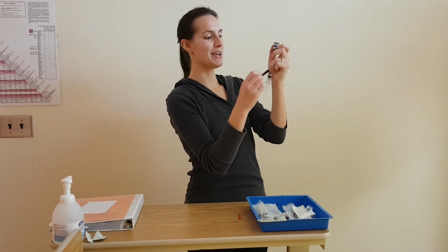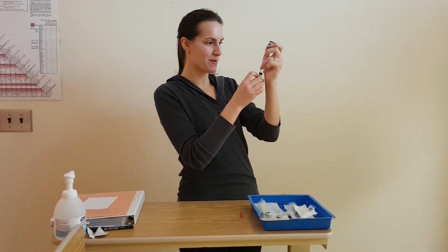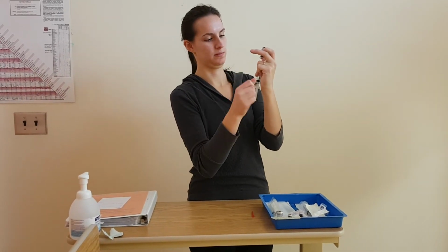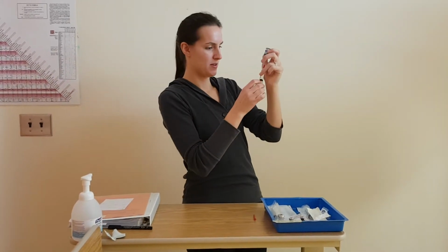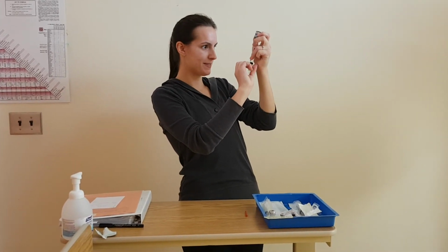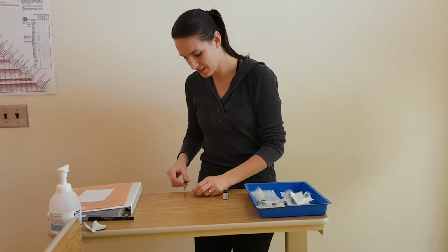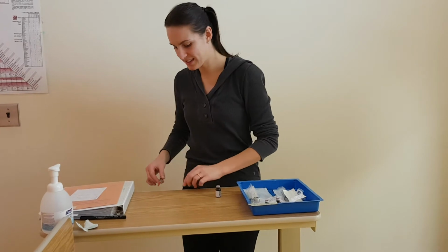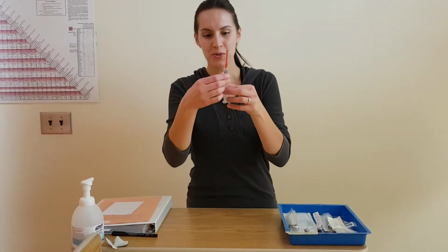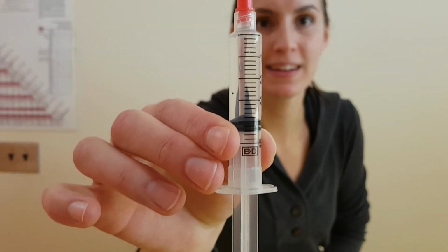I'm going to remove any air bubbles to ensure that I do have the correct dosage and volume of medication. So I have here my 4 milliliters. I'm going to use the scoop method to cap my needle to maintain its sterility and prevent any needle stick injuries. So I have here 4 milliliters of medication of furosemide.